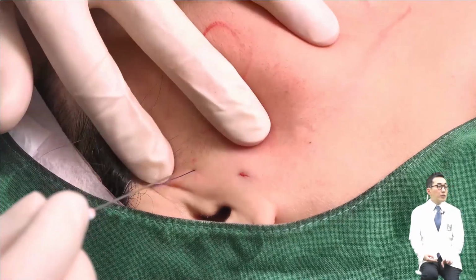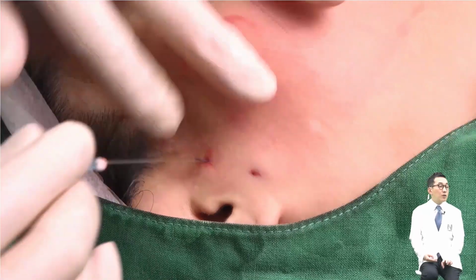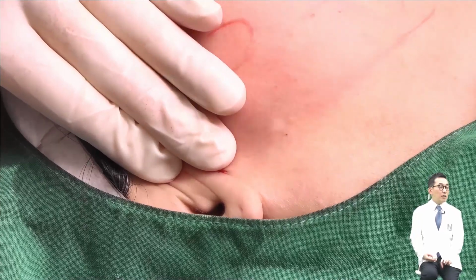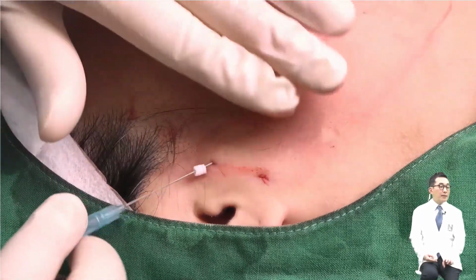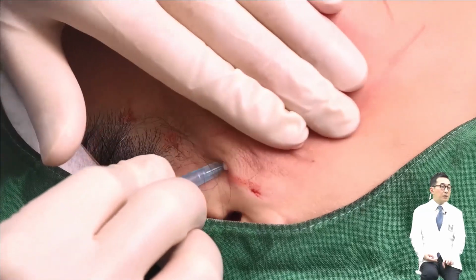And when you get used to it, you do not have to totally remove the cannula from the thread. With a slight bit of the end of the thread, you can push the cannula into the skin. But when reinserting, the thread length inside the cannula must not be more than 5 millimeters.